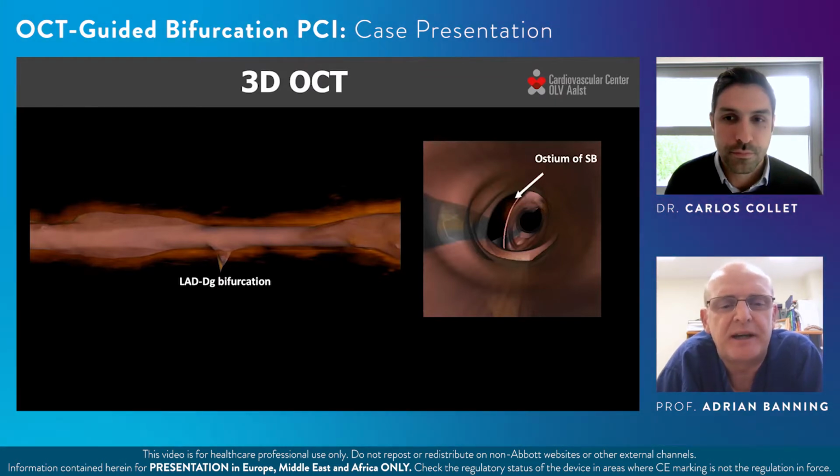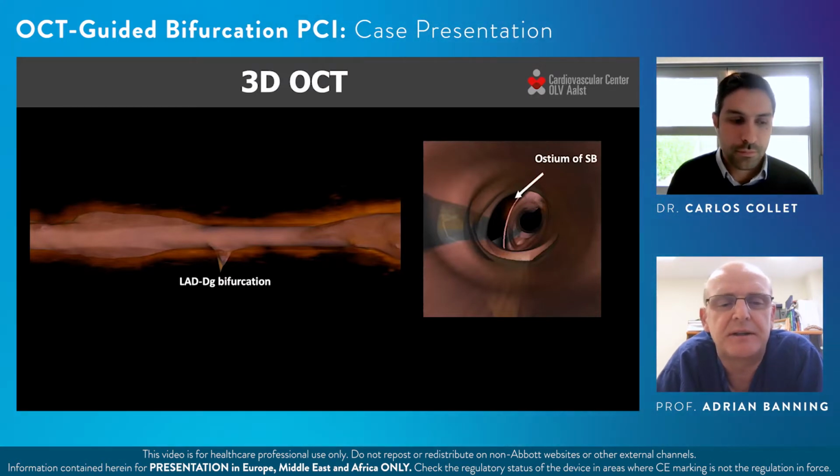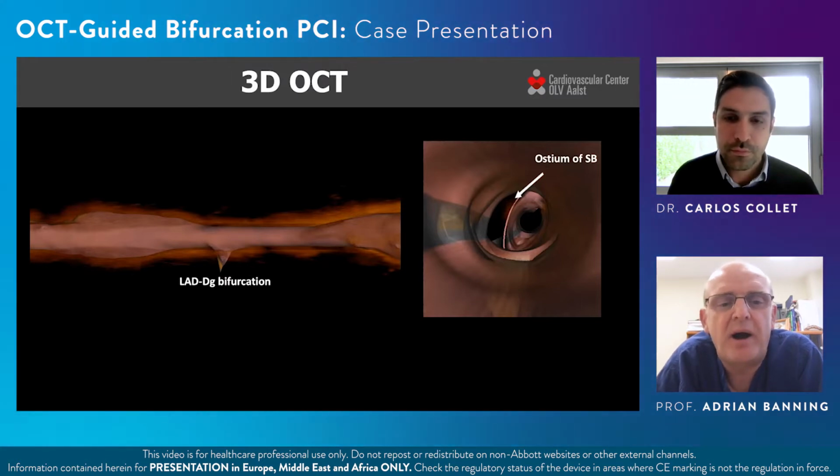So we do want to try and get a good result, a good angiographic result, and more importantly, a good functional result in the diagonal, as well as the LAD. And I guess the other question is, can we wire it? On the angiogram, and certainly on the OCT, you would think, yeah, it looks okay to wire.